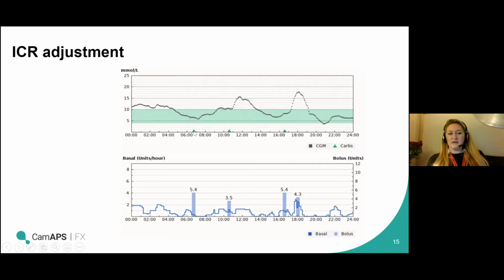It's kept the glucose fairly steady. It's drifted up potentially. The system's had to work a little bit harder between 8 and 10 just to try and keep on top of that. And then another bolus has gone in just after, between 10 and 11. And what you can see when that bolus of 3.5 units has gone in there is the glucose has really spiked. So straight away you're thinking, I wonder what's happening there.